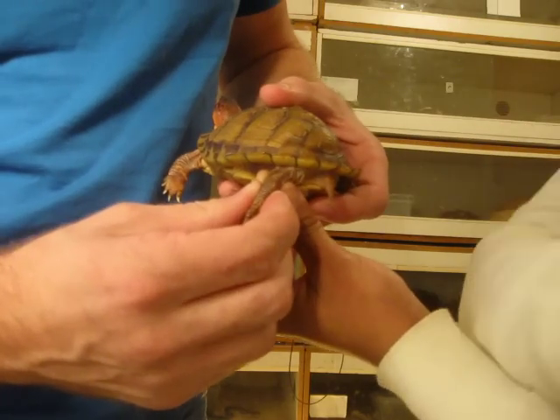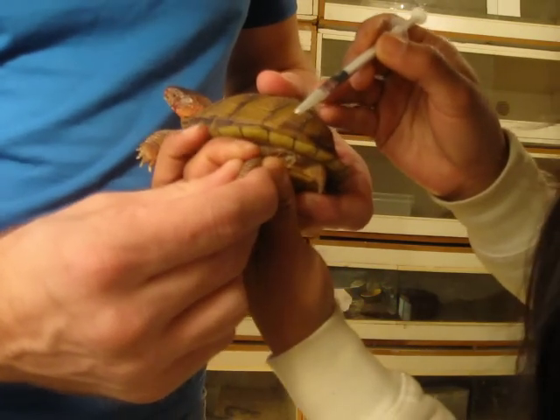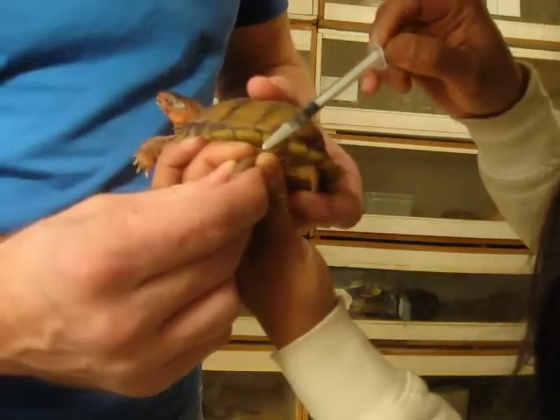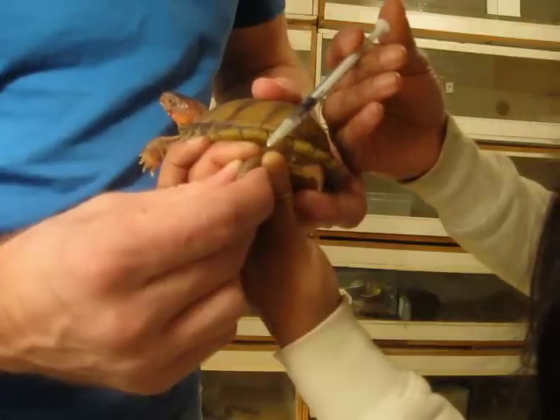Let's get a little more meat on than the other ones do. Now the injection has to go into the muscle, not into a vein. So we're going to put the needle in first, and then you're going to give it a little suck back to make sure there's no blood. And if there's no blood, we can continue with the injection.